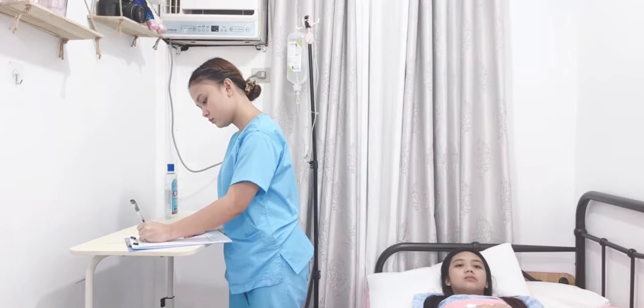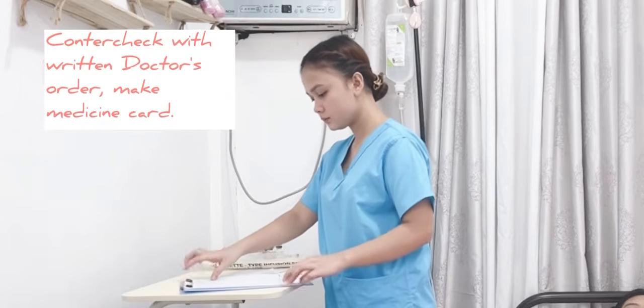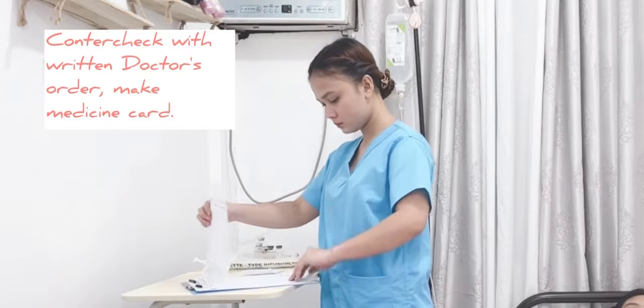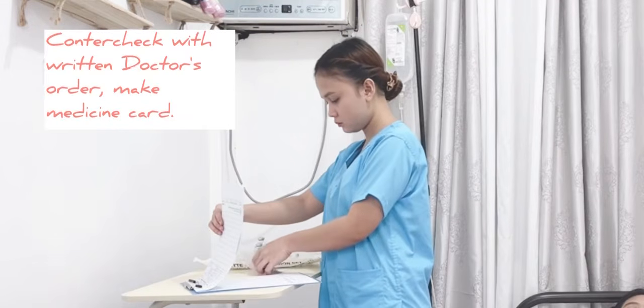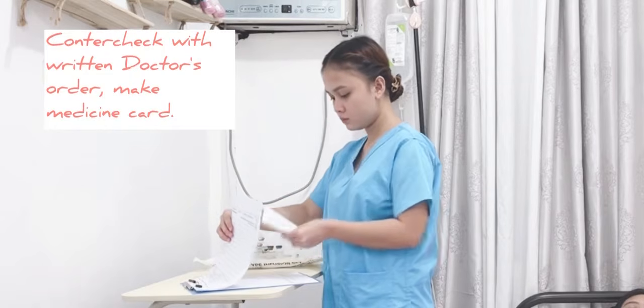Next is incorporation of drug into intravenous fluid. First is counter-check with written doctor's order and make medicine card. Client's overall physical condition and compatibilities of ordered medication dictate type of IV solution used to ensure safe and accurate drug administration.